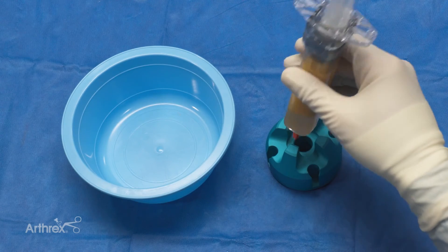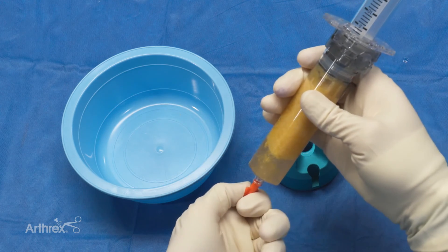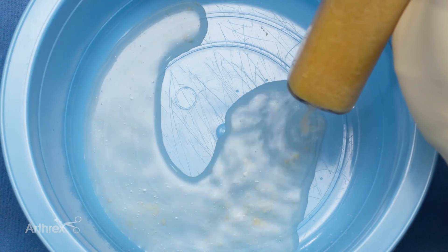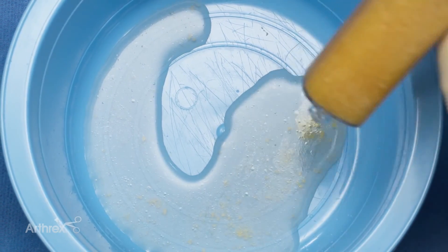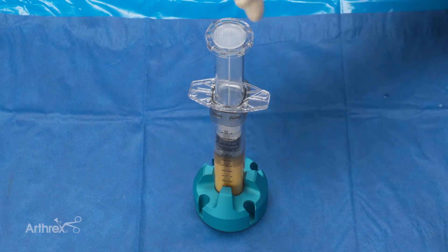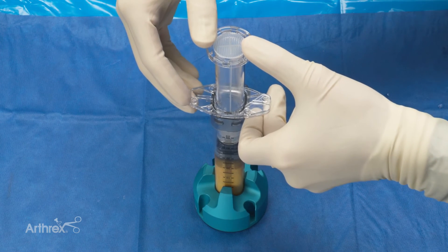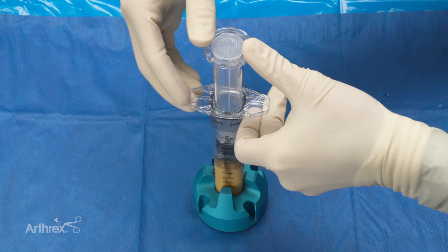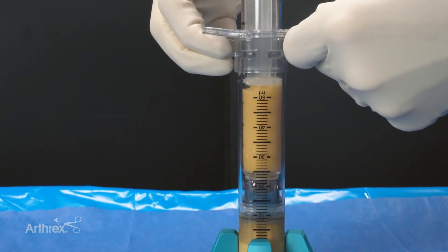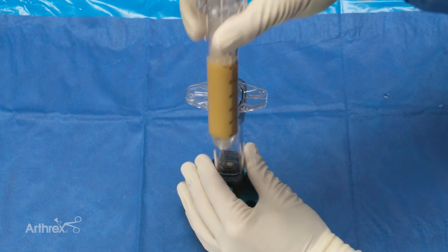Both wash steps have been completed — you can see the infranatant here — so we're ready to expel that. We remove the luer lock, unlock the syringe, and expel the excess fluid to get our final adipose product, which will then be ready to be resized through our filter. We place our fingers on the wings of the outer syringe, our thumbs on the outer ring of the inner syringe, and gently push — that's going to move the adipose through the 800 micron filter for the resizing step. Once it's been moved through the whole filter, unscrew the inner syringe and that's your final product ready for final transfer.